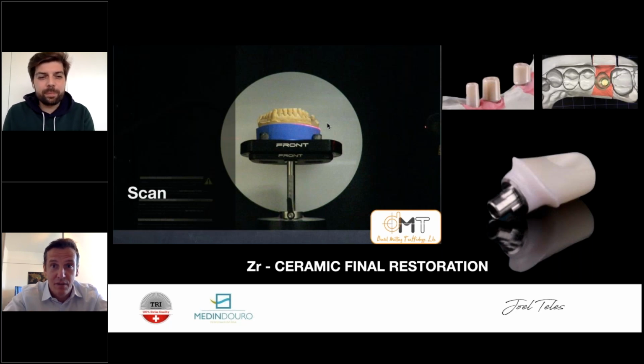We filtered them on the 15th again, so I can't pass all the questions to Joel, otherwise we talk here for the next 3 hours. But maybe you can just tell how you place the implant, is there a matter of the polished part subcrestal or not, and maybe say some words before going back to the digital prosthetic workflow.